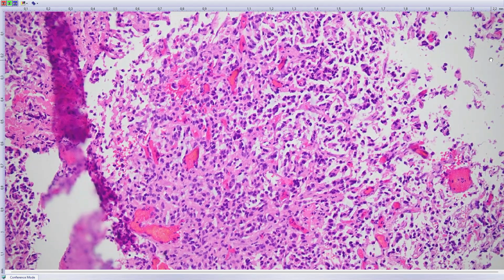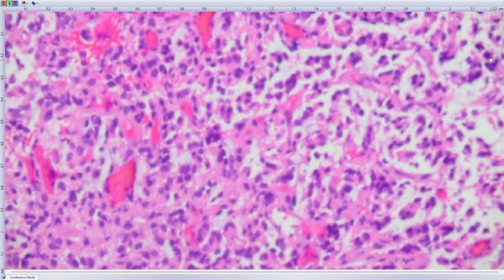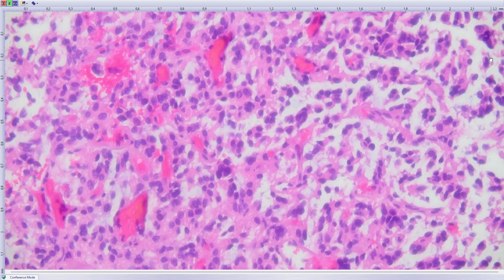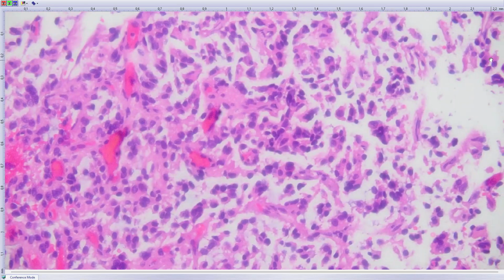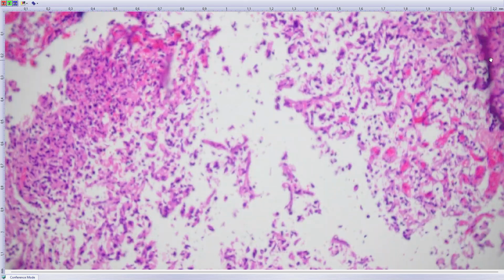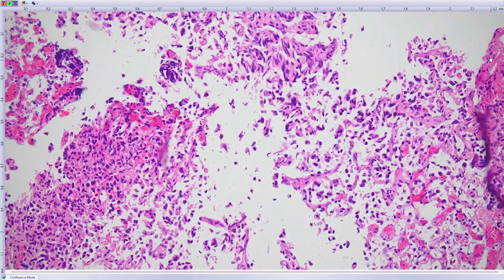And again, it looks rather nondescript, but it looks glial, and it showed OLIG2 staining, GFAP staining, and surprisingly there was quite some synaptophysin staining, so I didn't know what it is just based on H&E and immunohistochemistry.